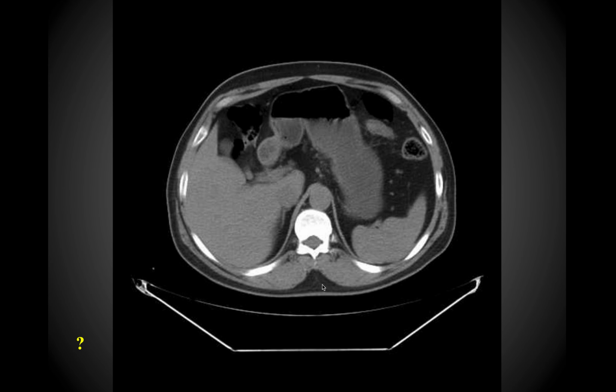Here we have another example. So we're going to run through a number of images here, going from the abdomen down into the pelvis in this patient. So first off, just to bring us back up to speed on this, you can see the aorta, you can see the hemidiaphragms draping off of that, the spleen over here, and then the liver right here with the stomach here in the midline. You can see this patient is obviously supine, where you can see the gas bubble sitting here in an anterior location. You can also see over here part of the descending colon on the patient's left.